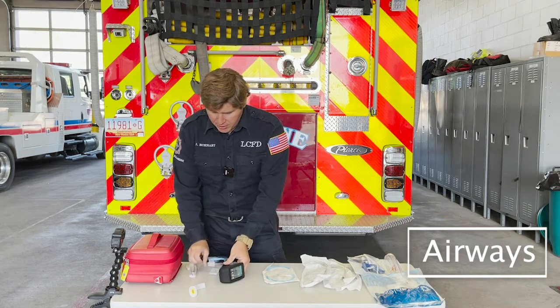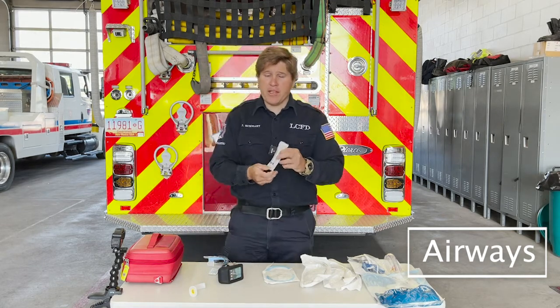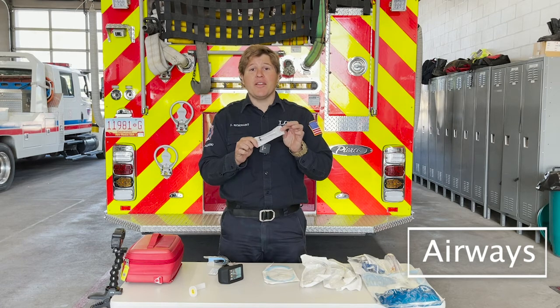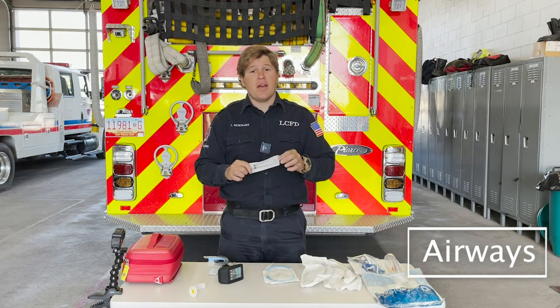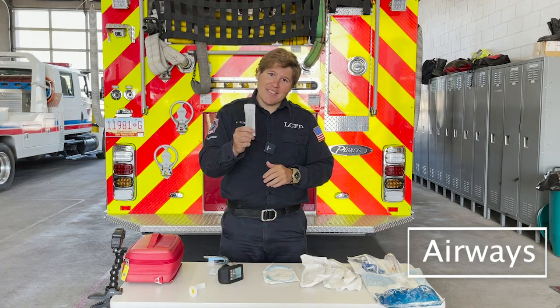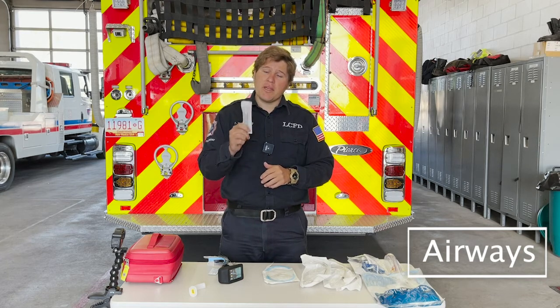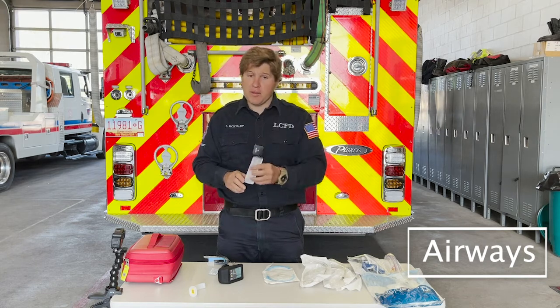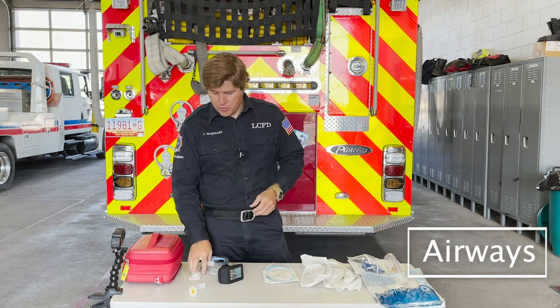Having that ready, a lot of times people forget one thing: get that 10 cc syringe out so that way you can inflate your ET tube. I've done it before. I've intubated someone and not had this out, and then it becomes a problem. So make sure you have that 10 milliliter syringe out and you test the bulb to make sure that endotracheal tube is going to work.